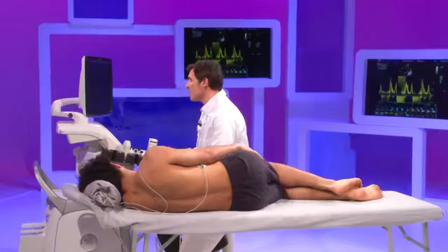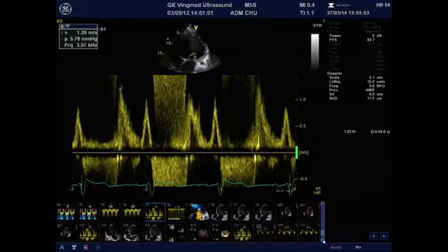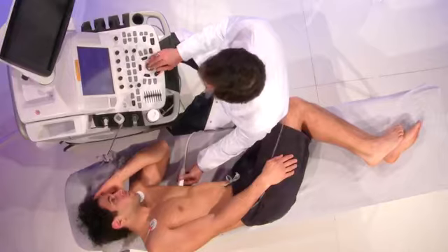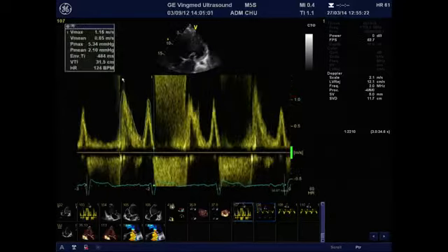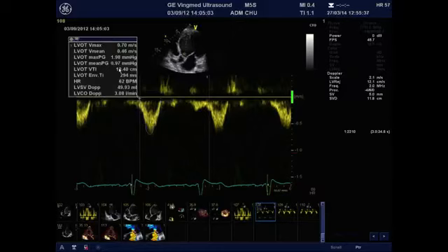And in some situations you can also trace the contour of the mitral inflow. So this is the TVI, and with the TVI you just need to get the LVOT flow across, you see, at the level of the LVOT. You measure it and you can just divide the mitral inflow here, 31, by the LVOT flow here, 13, and if the ratio is over 1.4, it is in favor of severe MR, and in this situation it is really concordant with a severe mitral regurg.